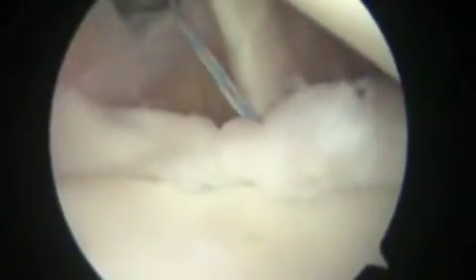So outside the shoulder through that cannula, we're tying knots, and then we're using that instrument to push that knot down through that green cannula, down right onto the labrum, and we're pushing really hard so that we can secure that labrum back to the socket with the knot. And when we're done, we use an instrument to cut the sutures right above the knot. So we just cut them.